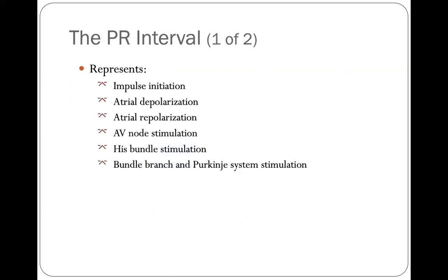I will say that there's a mistake on this page that I didn't notice before, but atrial repolarization often happens outside of the PR interval and hidden in the QRS complex. So please don't be confused by that. I will remove that in the future. I didn't mean to have that there.